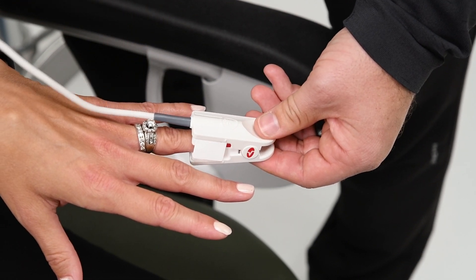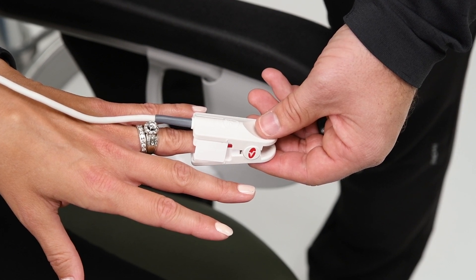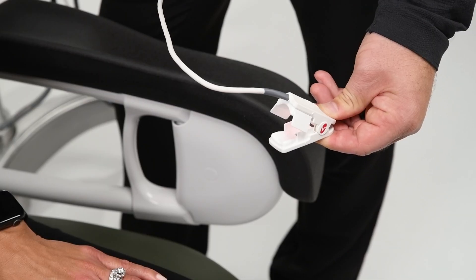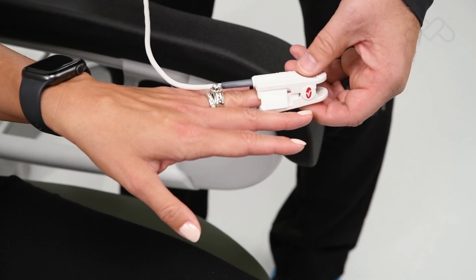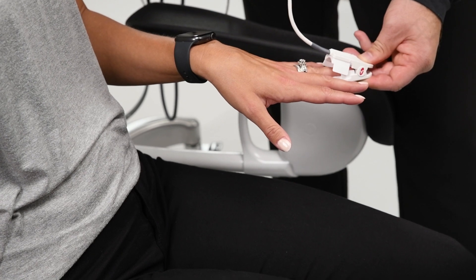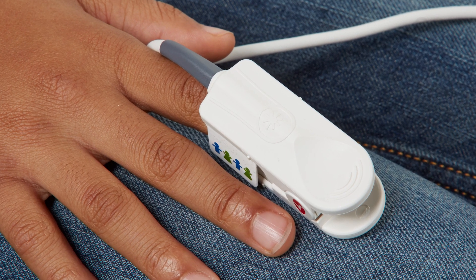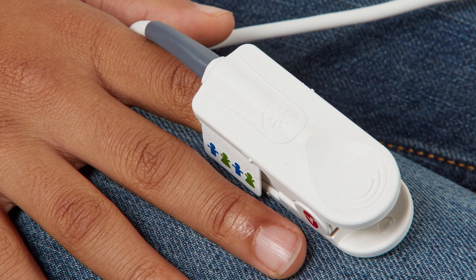The top half of the sensor is identified by the cable. On a finger site, the top of the finger should touch the raised digit stop inside the sensor. If the fingernail is long, it may extend over and pass the finger stop. The hinge tabs should open to evenly distribute the grip along the length of the finger. Check the position of the sensor to verify correct positioning — complete coverage of the detector window is needed to ensure accurate data. Orient the sensor so that the cable runs toward the top of the patient's hand. When using smaller digits, in order to completely cover the detector window, it may be necessary to use a lower weight range sensor.